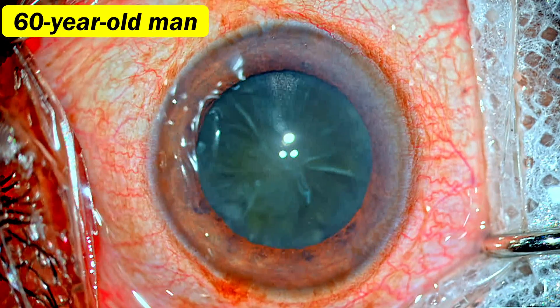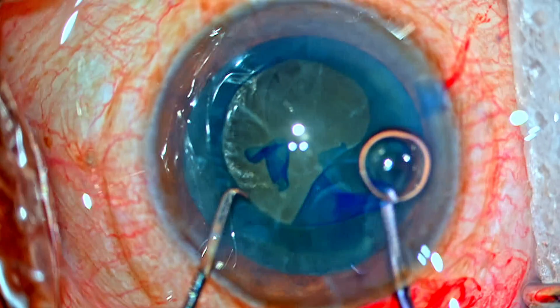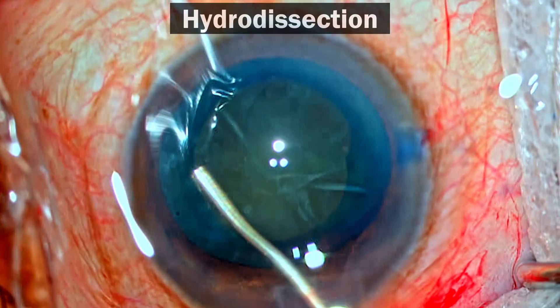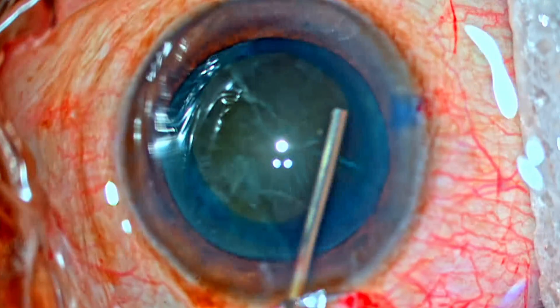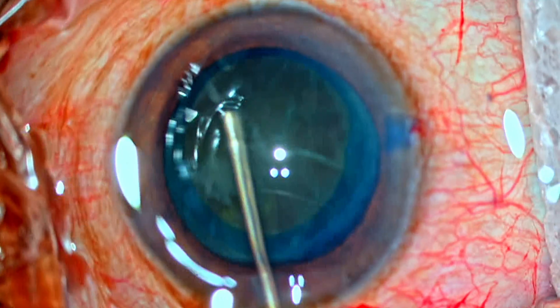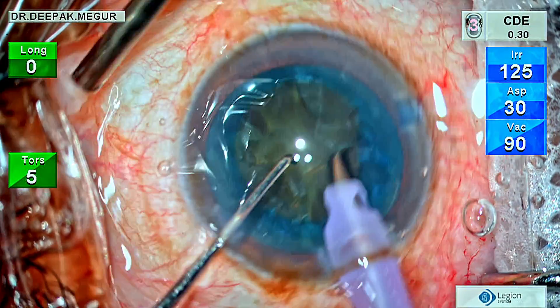This is a 60-year-old diabetic patient who has come for cataract surgery. The nucleus has a brownish tinge, and I thought it was probably a grade 3 nucleus. But once I did the rhexis and the hydrodissection, I couldn't do hydrodelineation because the nucleus was a little bit brittle — in such diabetic cataracts, you don't get the hydrodelineation right at all. There is no separation of endonucleus and epinucleus; the entire mass is crumbly and difficult.